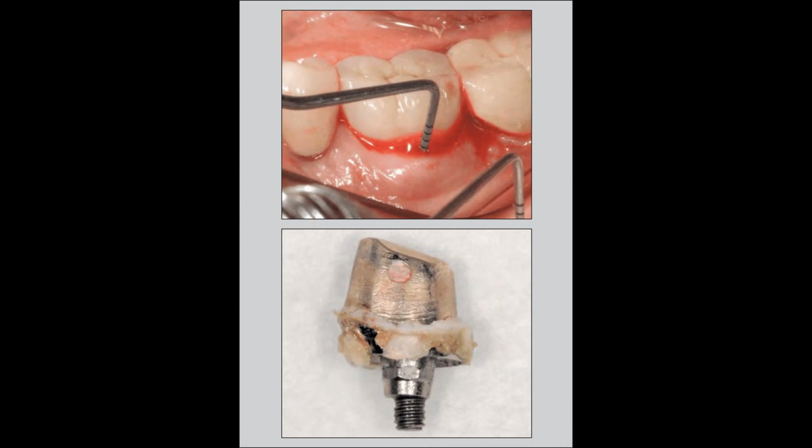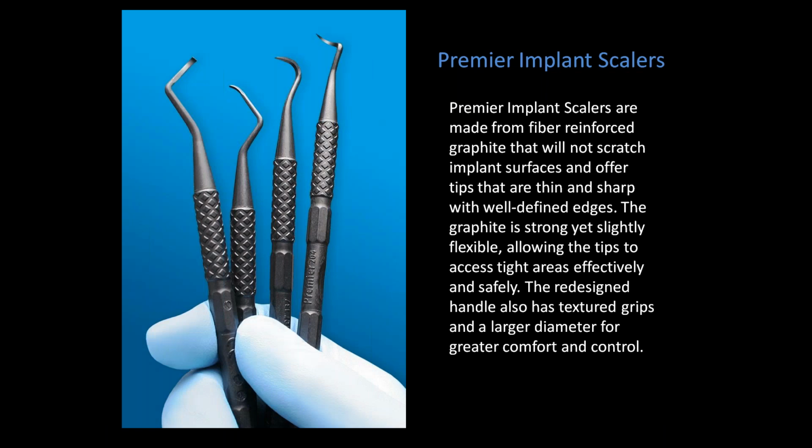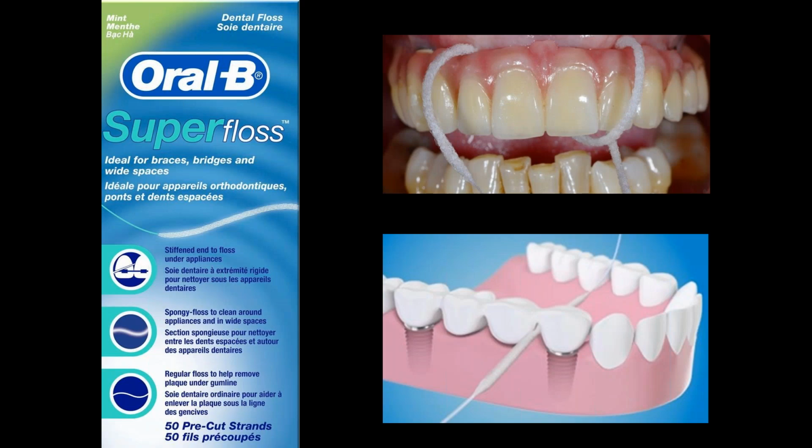We want to avoid peri-implantitis caused by placing too much cement, whether it's temporary or final cement. We never want to fill the restorations with that much cement. And so here you can clearly see the gingival health. So we were actually able to go to final restorations within 6 to 8 weeks in the lower arch. In the upper arch, we obviously wanted to wait a little longer. And here we clean any excess cement with our scalers, and we review the oral hygiene instructions with our patients.